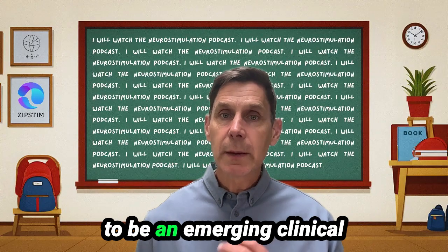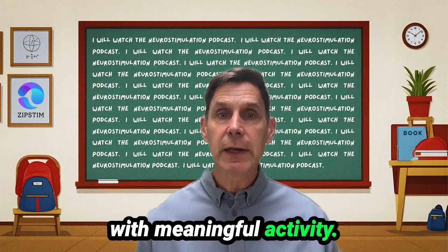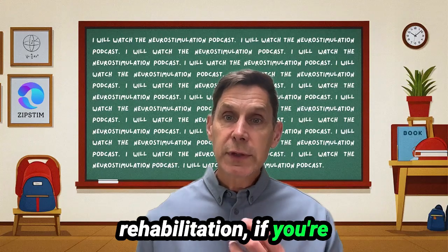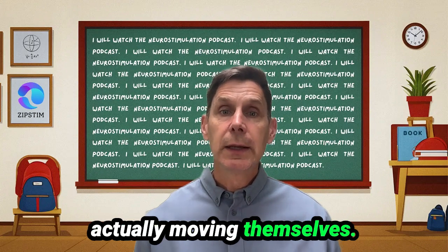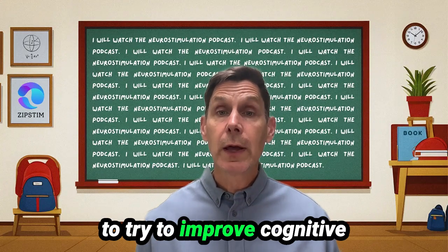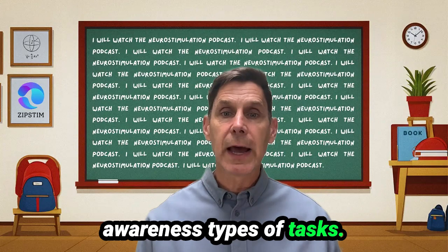So here's what seems to be an emerging clinical pearl based on the research that's coming out in this area. tDCS seems to work best when it's paired with meaningful activity. So, for example, if you're looking at post-stroke motor rehabilitation, if you're stimulating the motor cortex with tDCS, it seems to have an improved effect when the patient is attempting or actually moving themselves. If you're stimulating the prefrontal cortex in order to try to improve cognitive function or mood symptoms, then it might be helpful to have the patient engage in cognitive or emotional awareness types of tasks.